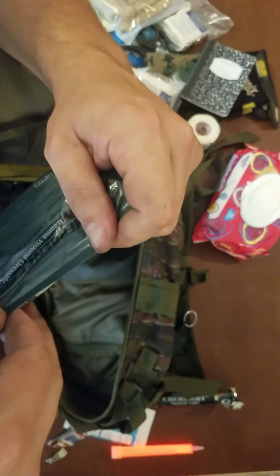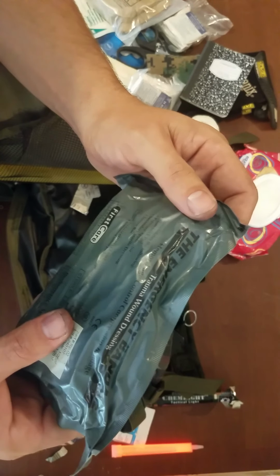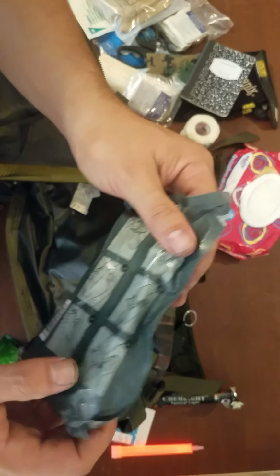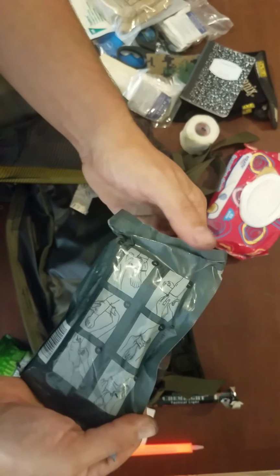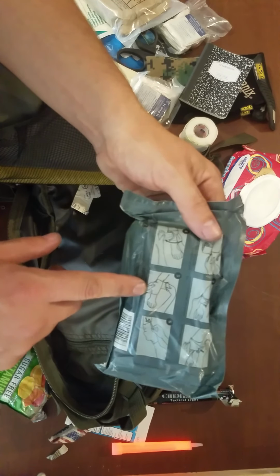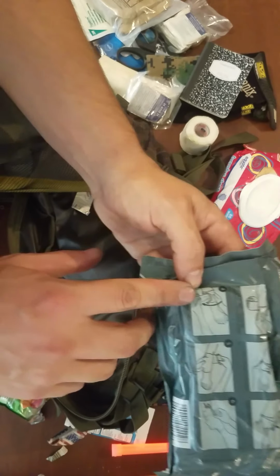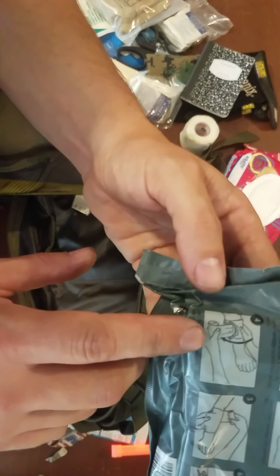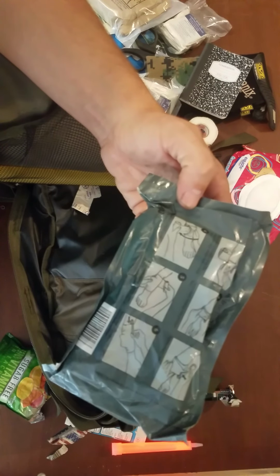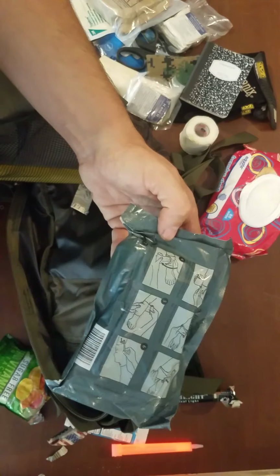This is another trauma bandage. It's similar to the other one that we have. Again, you'd shove this one in and wrap it around. They used to call this one the Israeli bandage, but then people got upset because of Israel. I don't know if you can see it, but on here it shows a clip. You're going to put your bandage on, stop the bleeding, and then use this to go over the top.